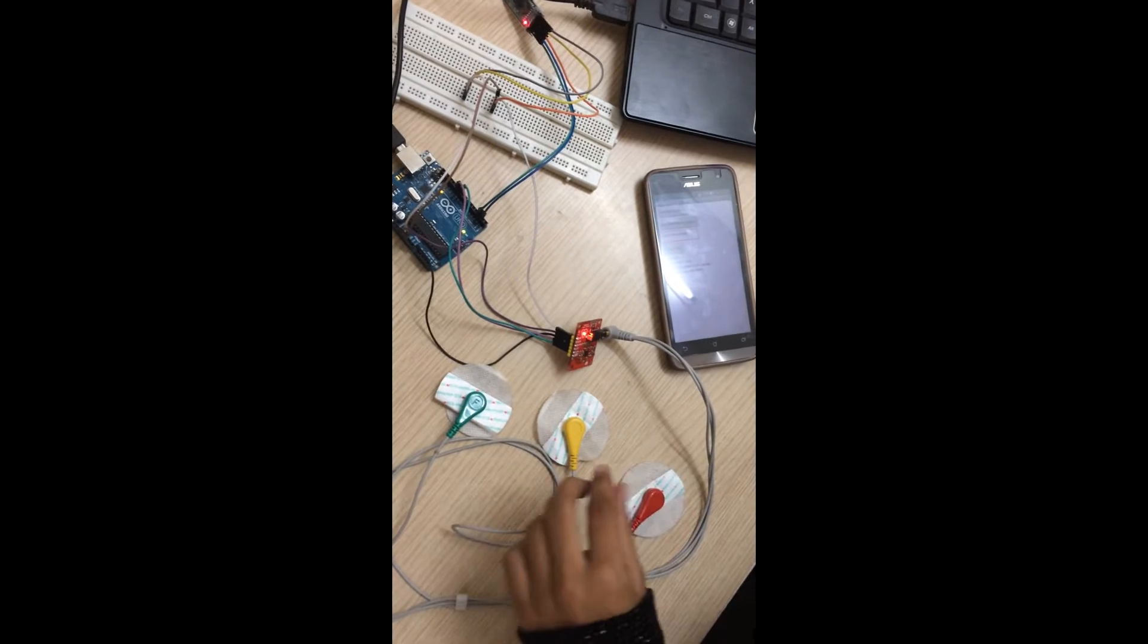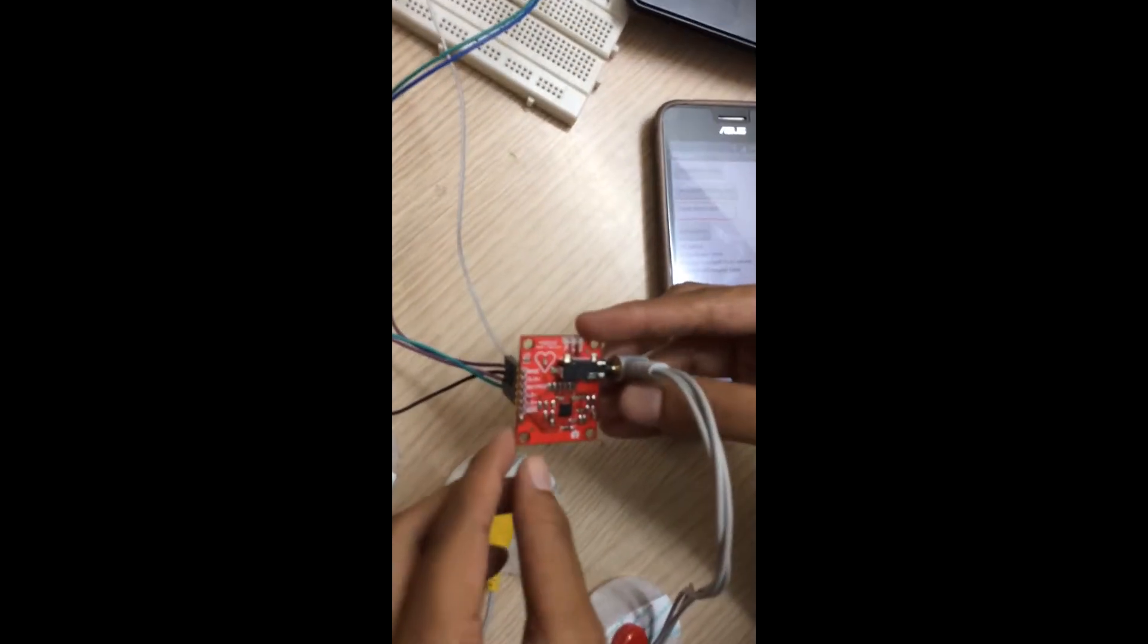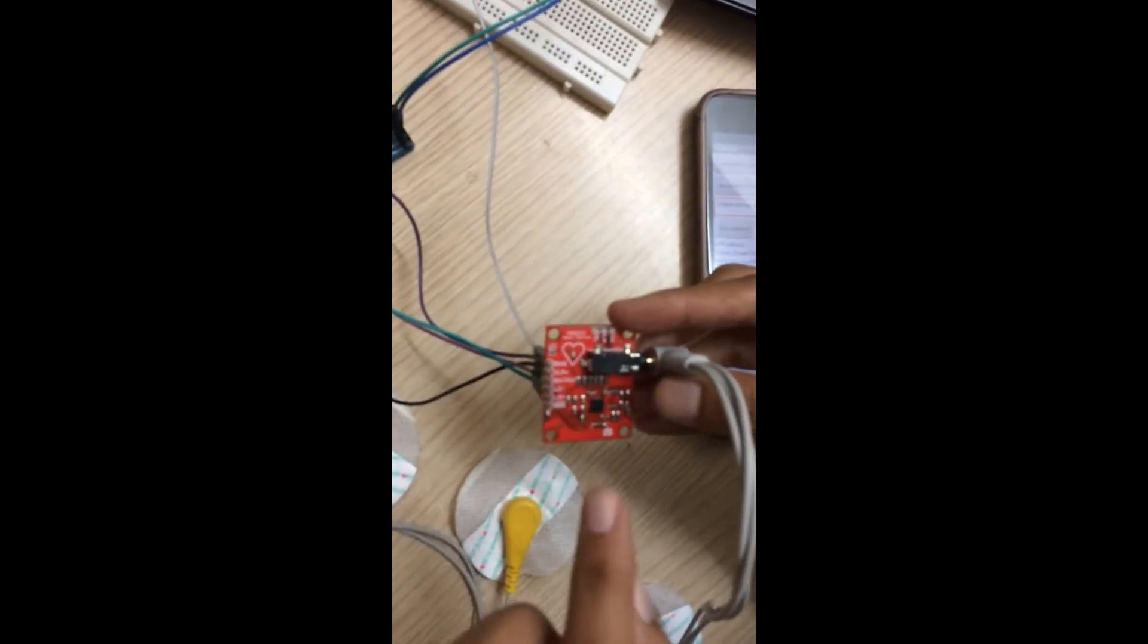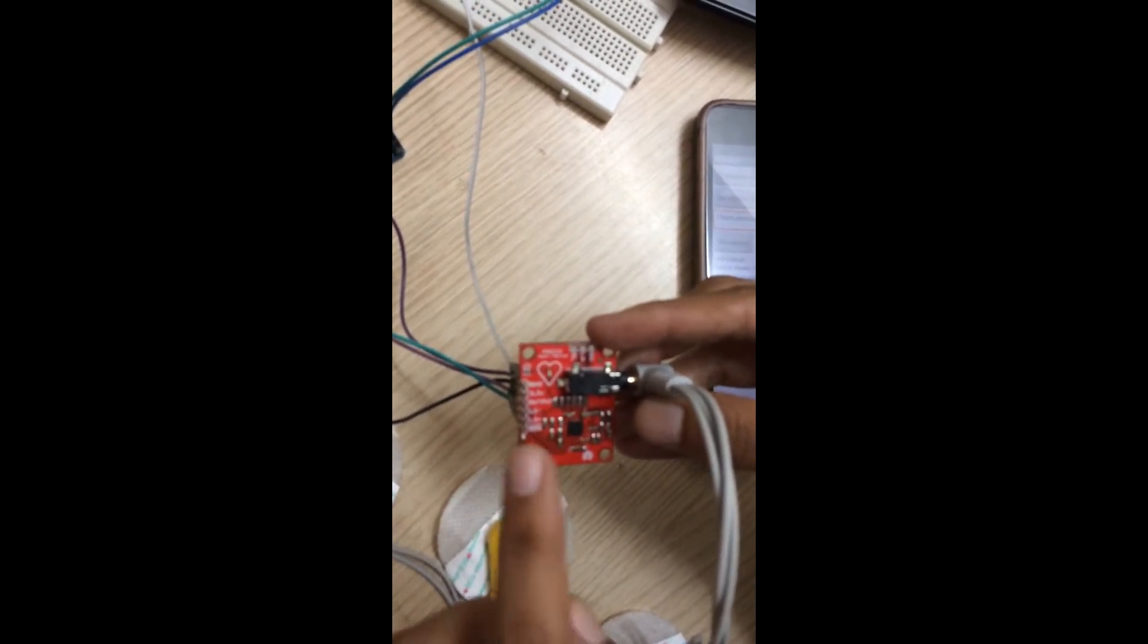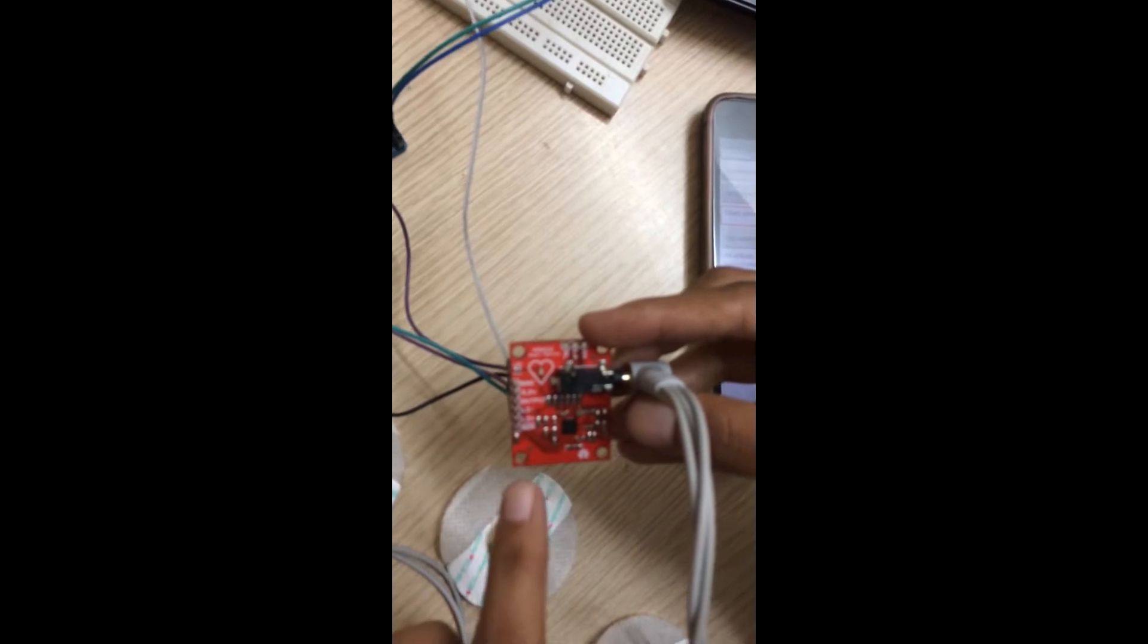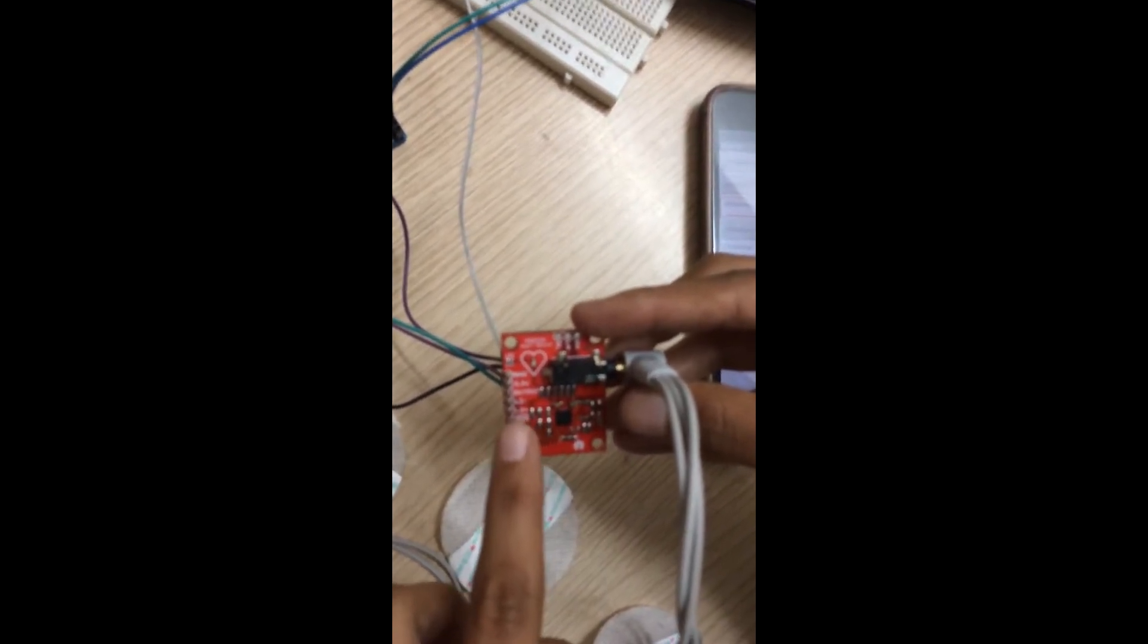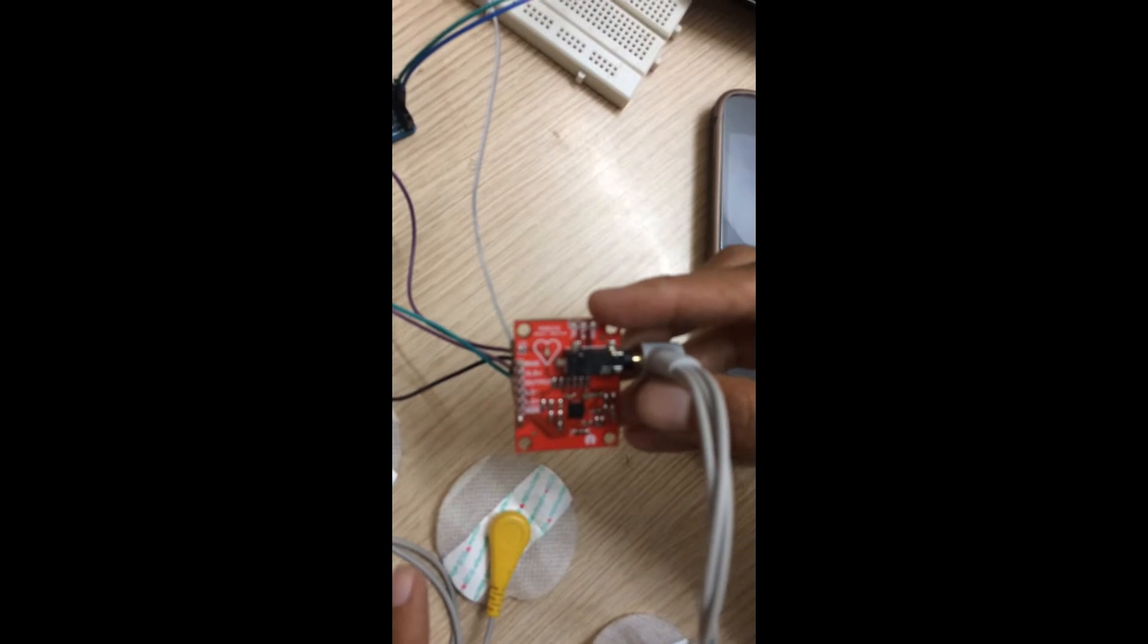This is the ECG sensor AD8232. It has 20 pinouts but external pins are only 5: ground, VCC, output, lead minus and plus, which will indicate whether the electrodes are connected or not.